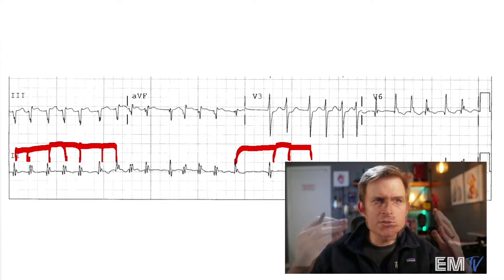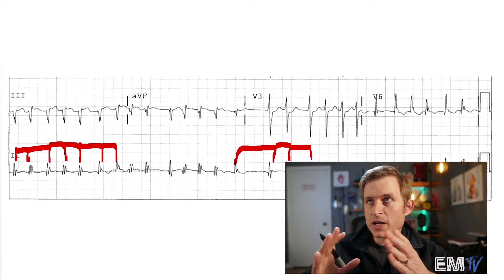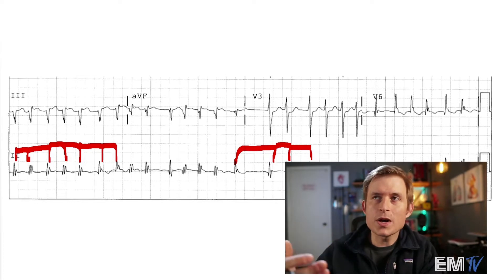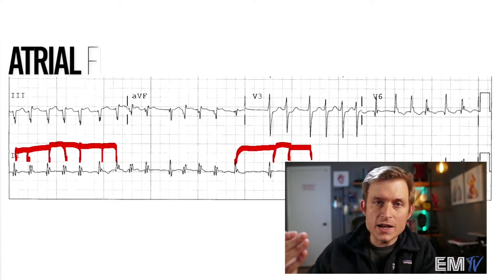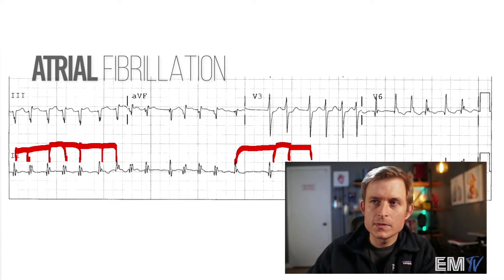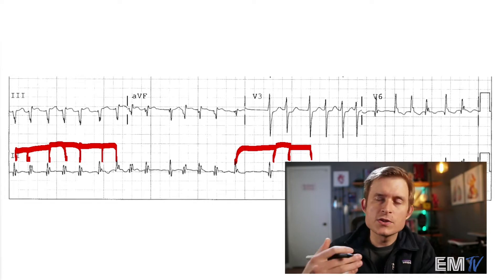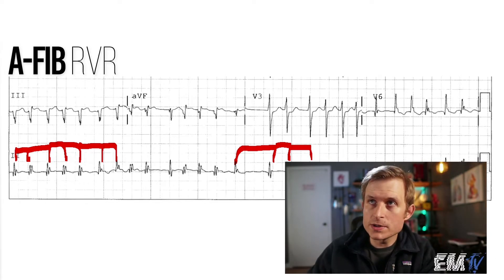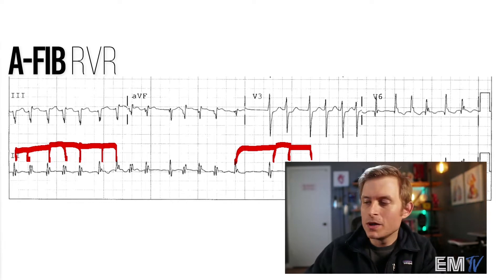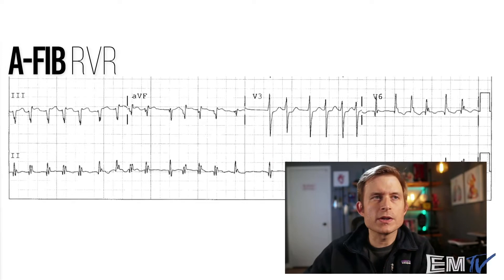Every once in a while, something conducts further down the conduction pathway. Because you have a conduction pathway distal to the atria, this is why we get conducted QRS complexes. Without examining this any further, this is atrial fibrillation. The rate is significant though, so I'd add that this is atrial fibrillation with RVR — rapid ventricular response, or rapid ventricular rate. Lead 2 is kind of ugly looking — there's like an RSR prime, or a fragmented QRS complex going on here.